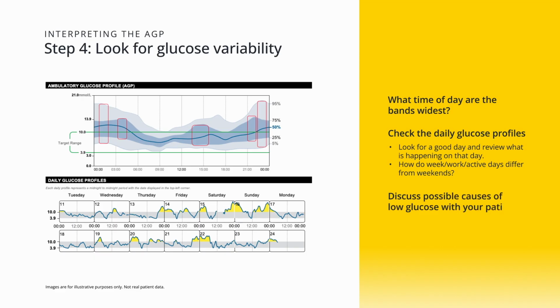High day-to-day glucose variability can be an indication that your patient is inconsistent in managing their diabetes, and there are more factors to consider than insulin dose adjustment. The patient may be inconsistent with their dose and timing of insulin, particularly in relation to meal times. They may be selecting lumpy injection sites or have poor injection technique, or they may have inconsistent meal sizes or proportion of carbohydrate. Sometimes there are lifestyle or behaviour-related causes, such as unplanned activity or exercise, occasional alcohol intake, or stress or illness.